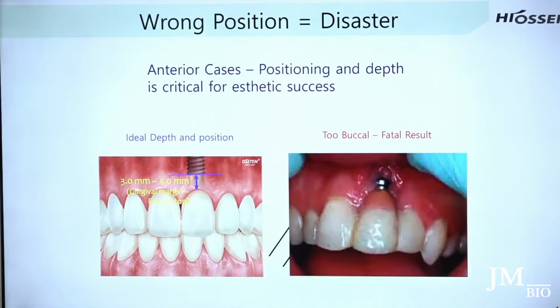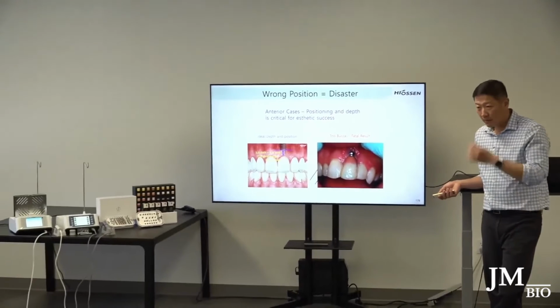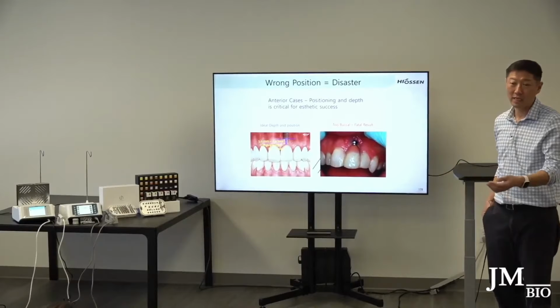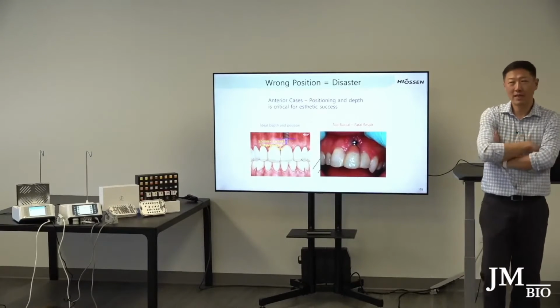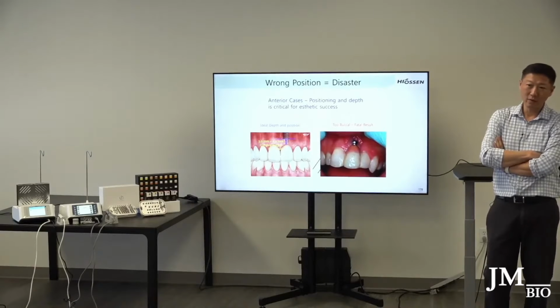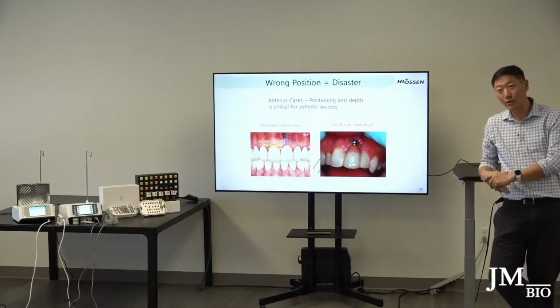So I'm going to tell you a story. I had a case. I do courses in Indiana. One of the doctors came and took a surgical guided case in Indiana. She did the case, right? And then this case came back to me. She brought the case to me afterwards, and I was looking at it. She asked, how am I going to restore this? I said, why, what's going on? She asked whether there is a multi-angled abutment I can use to try and angle my implant back down. And she said, I did the surgically guided. And I was like, well, good. It must be good, right?